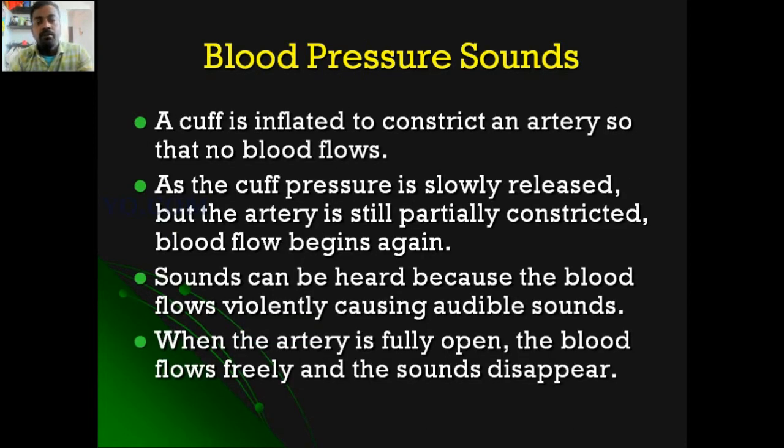Then blood pressure sounds. Why do doctors observe some sound while measuring blood pressure? There is a sound present when we are measuring blood pressure. A cuff is inflated to constrict an artery so that no blood flows.